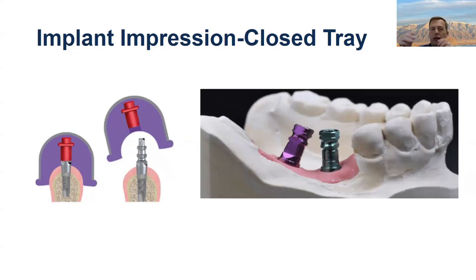As long as we get it back in the same position and it doesn't compromise the ability to clock it, that can be fine, no problem. Feel free to do that. But do make sure that you send the open tray coping, or sorry, the closed tray coping and the screw. And as one of our participants mentioned, if you have an analog and want to load it, that'd be great. Otherwise, your laboratory can load it.